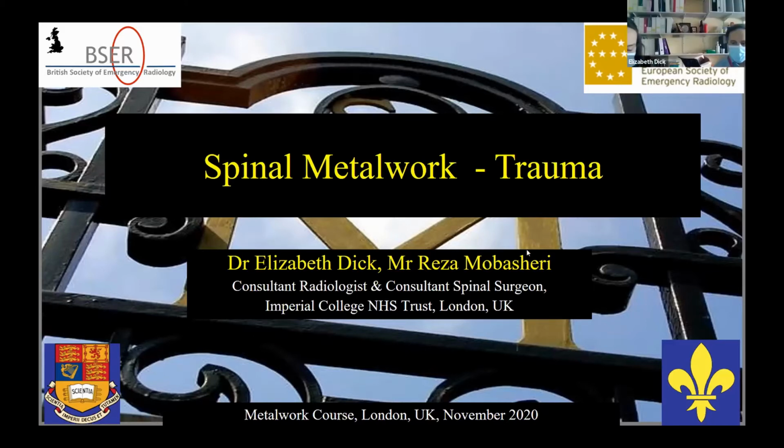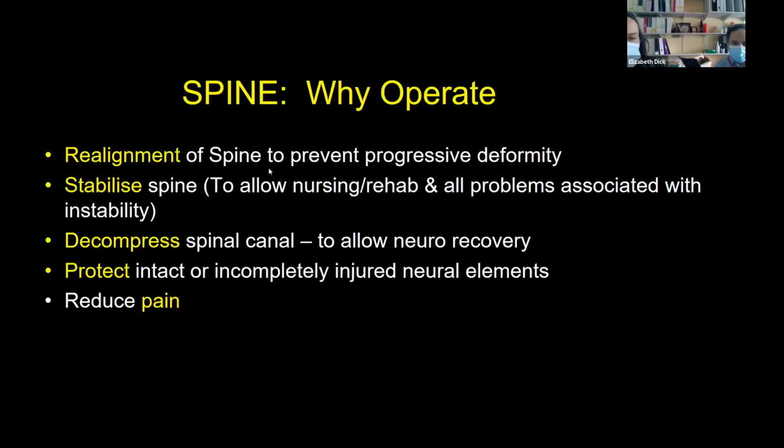Okay, great. Thank you, Dimi. So we're going to talk about spinal metalwork in trauma, and please shout out if you can't hear me well enough. So let's move on to the next thing. Here we go. So why do you operate in a patient with spinal injury, Reza?